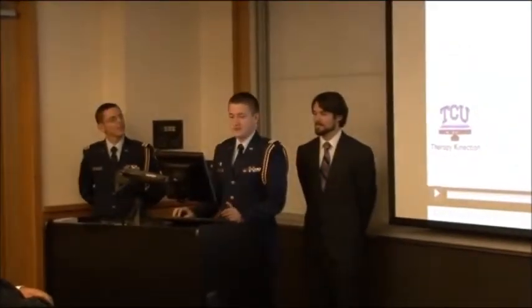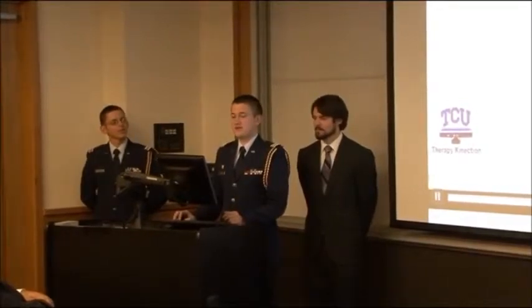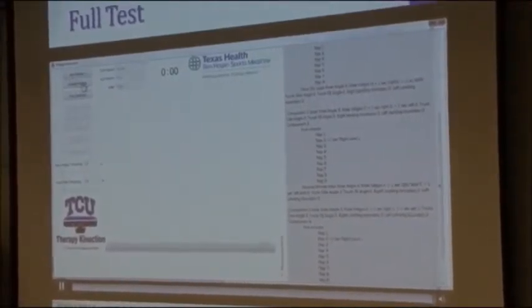And so now that it's done, we can hit stop test to end the test, and all the results are stored in the database. And once that is completed, the therapist now has the choice to either add a new patient, search another patient, or test Scott again if he really wants to go for seconds.